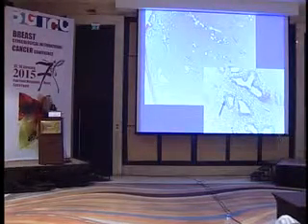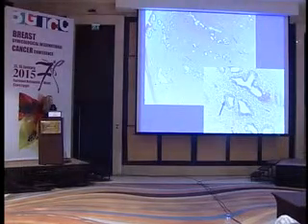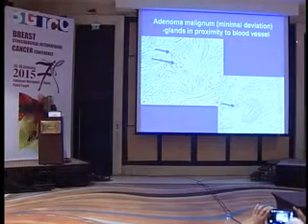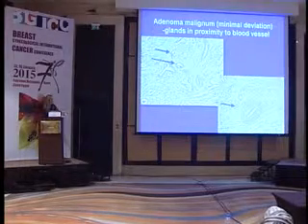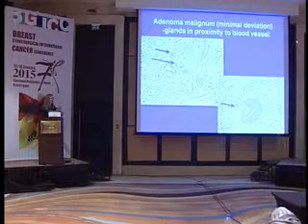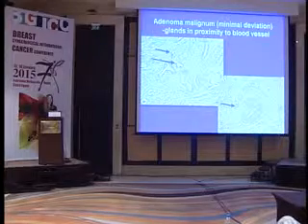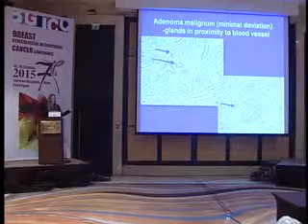Look at that. Over here, you say, I want to do endometrial metaplasia, what am I dealing with? Look at high power. You've got mitosis, you've got ugly-looking cells. More close to the vessels, this is a vascular channel. And look here, these are vessels. These cells love to go close to the vessels. And angulated, bizarre looking. So whenever you pick up on one atypical gland, you'll see the rest. It'll be easy. It'll start showing and showing. The good thing is it's such a rare tumor. Honestly, in my 13 years of practicing, I think I saw only 5 cases.